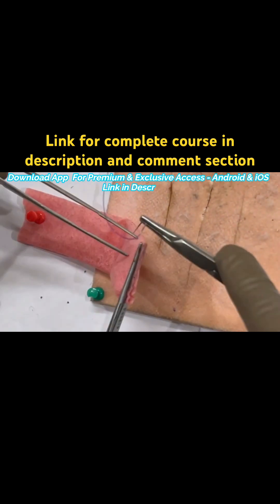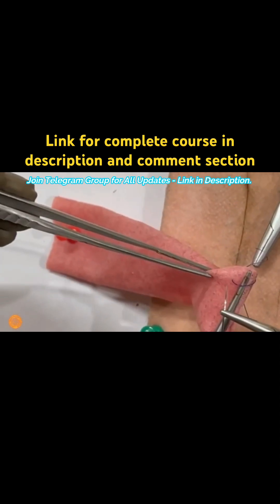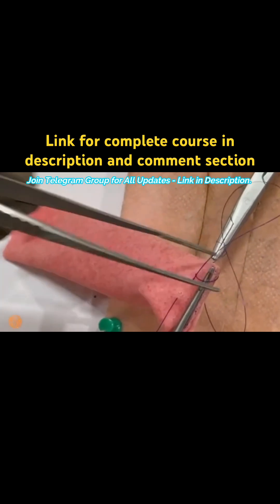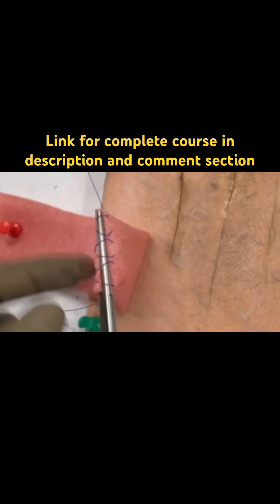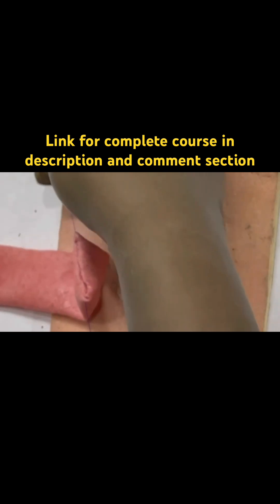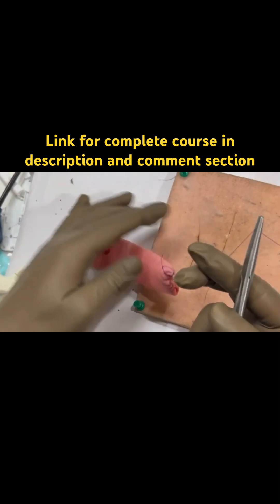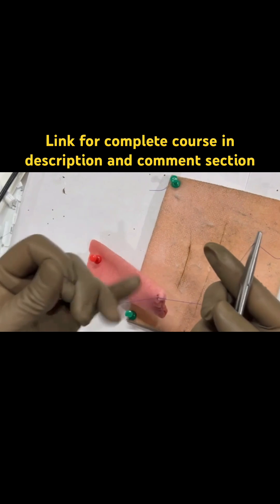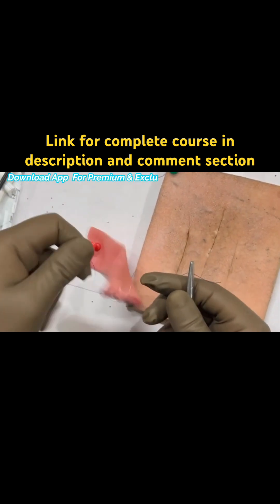Pressing on the bowel wall approximately three to four millimeters — don't tighten these ligatures. This is a very beautiful technique and it helps to achieve a positive outcome. Continuing this pyloroplasty series, the tension closure suture is the near-far-far-near technique. Now we will move on to the practical demonstration.